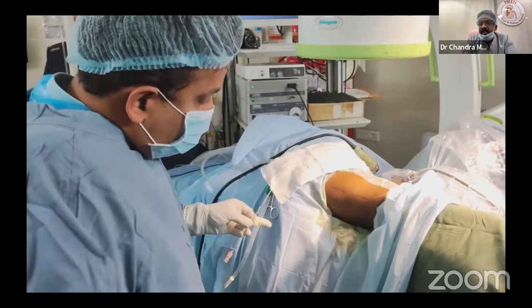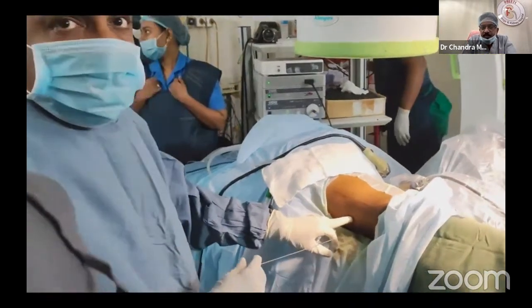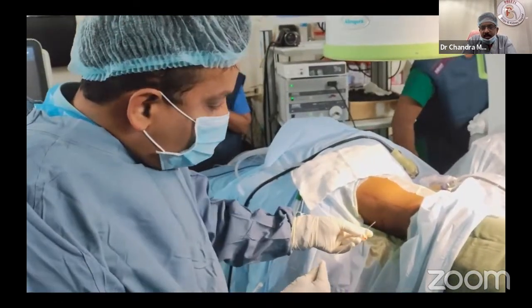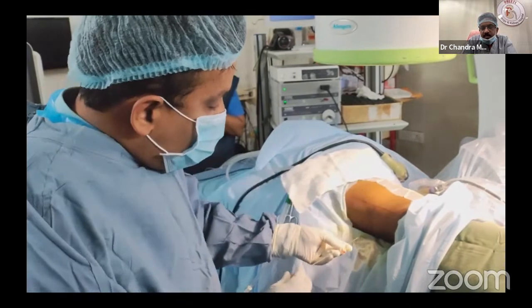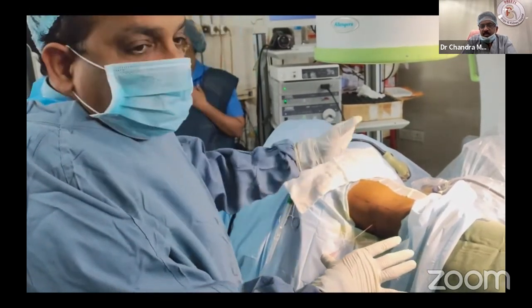The practical guideline here is below the 12th rib. If you put the needle in the line 1 or 2 centimeters below the 12th rib tip for the initial puncture, you will be very, very safe. Maximum 2 finger breadths below the tip of the 12th rib, exactly like in this case. You can observe one spot to go in that direction. When I kept it like that, that means this is horizontal, not above or below. I will go horizontally like this towards the calyx.